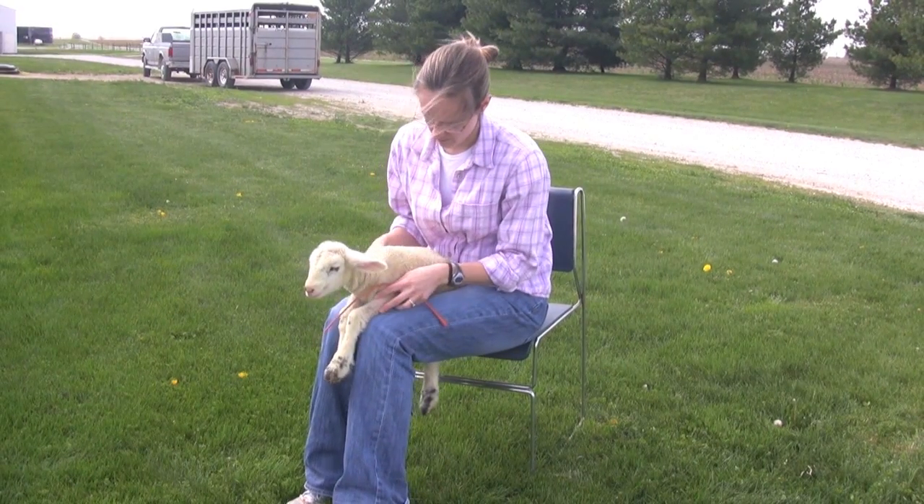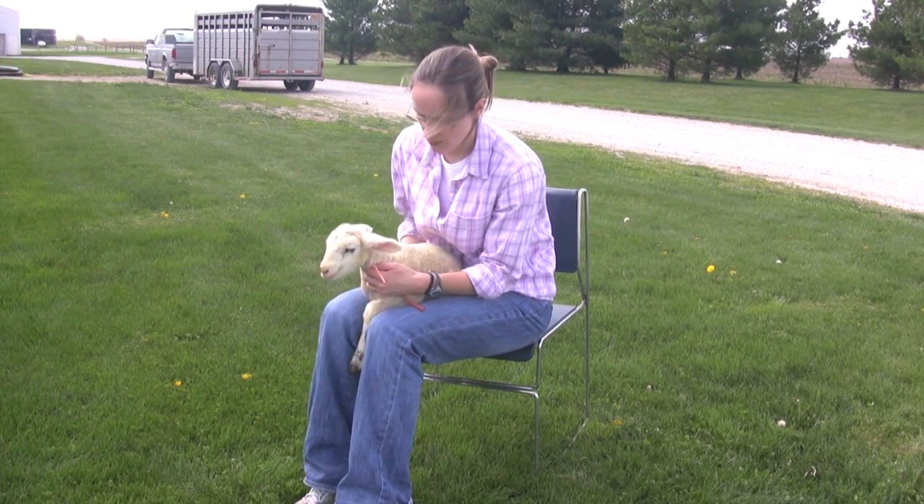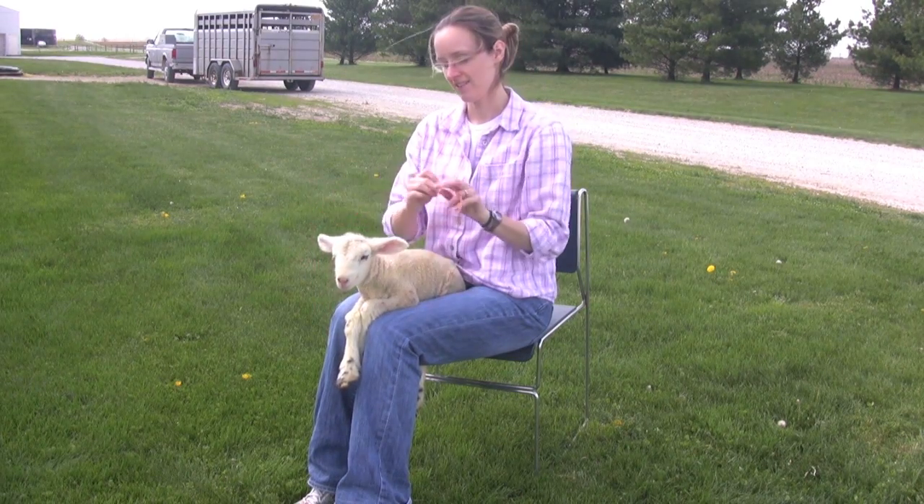When you are ready to begin, hold the lamb in a natural position. Never tube feed a lamb on its side or it may inhale the milk. We suggest that you sit and hold the lamb between your knees.